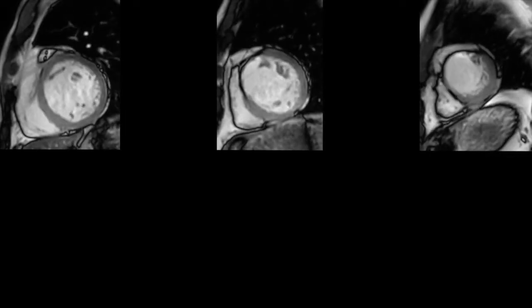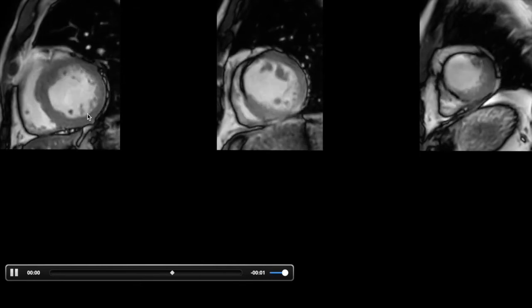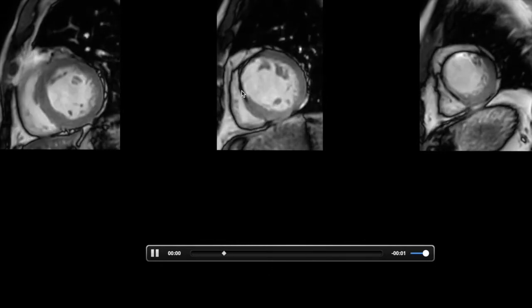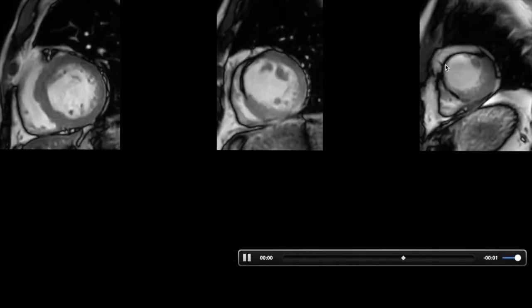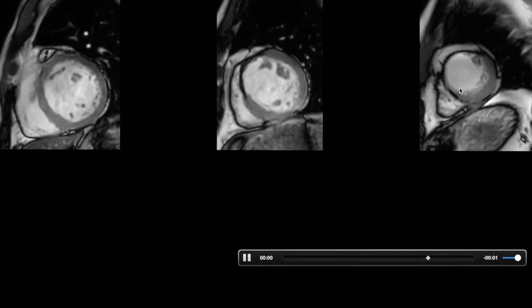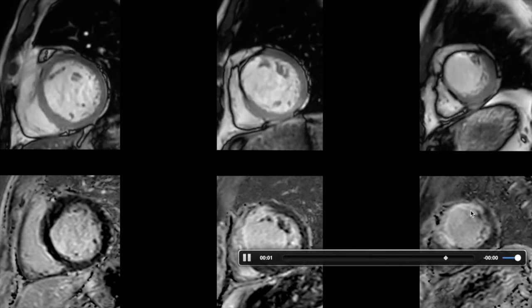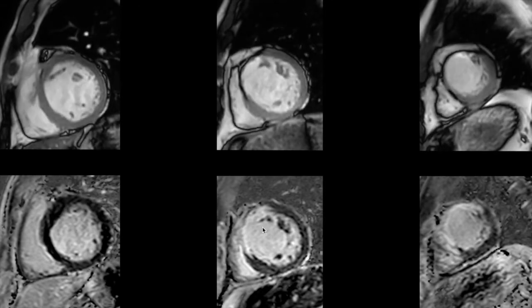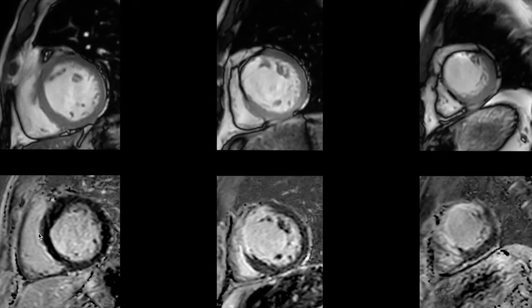Short axis images demonstrate good wall motion at the basal cavity with no areas of hypokinesis. At the mid cavity, the mid anterior and anteroseptal segments are thinned and akinetic while the inferior and lateral wall function well. At the apical cavity, the apical anterior segment and apical septum are thinned out. Corresponding delayed enhancement images show transmural infarction in the apical anterior segment, apical septum, mid anterior, and mid anteroseptal segments, while all other segments have normal delayed enhancement.